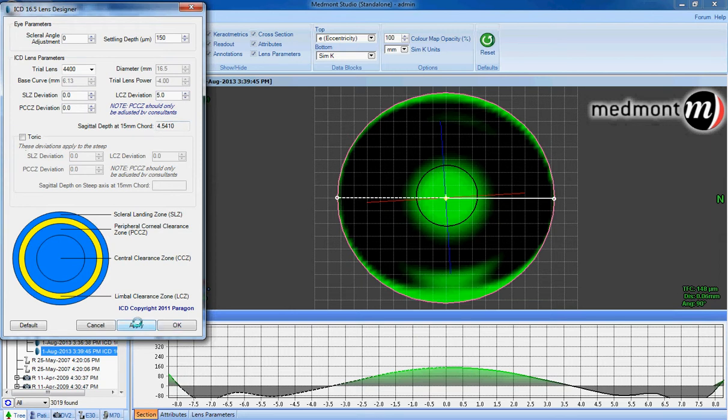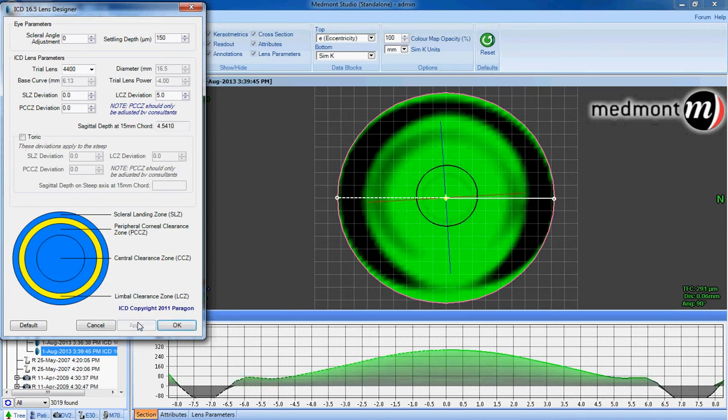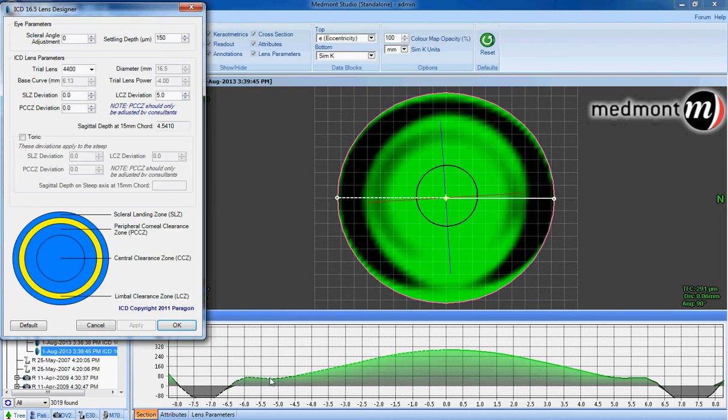Once that modification is made within the Medmont contact lens software, we can see whether we've created that healthy amount of fluid, that healthy amount of vault between the surface of the eye and the back surface of the lens. With the limbal clearance zone plus 5, we're still just under 80 microns of fluid.